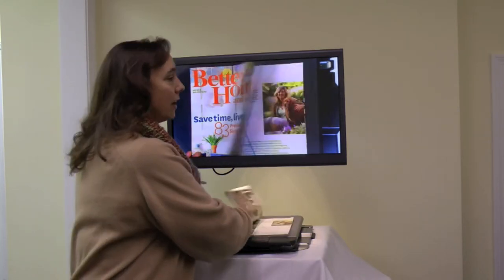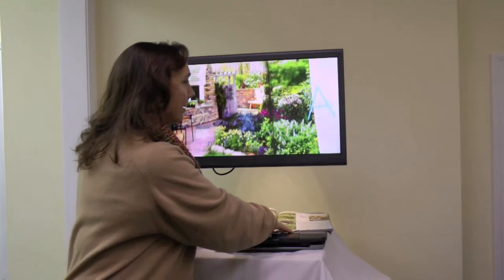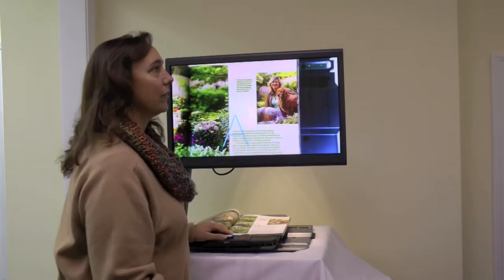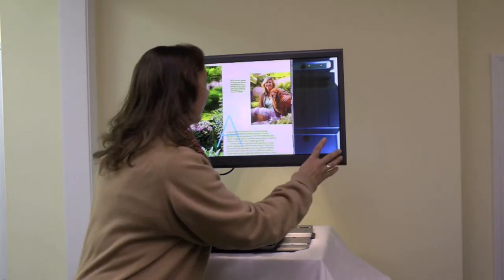This video magnifier is a great way to appreciate beautiful photographs again, like you can in this magazine. But then there's very often articles along with those photographs, and we'll skip that because the reading is too challenging. Well, you don't have to anymore.